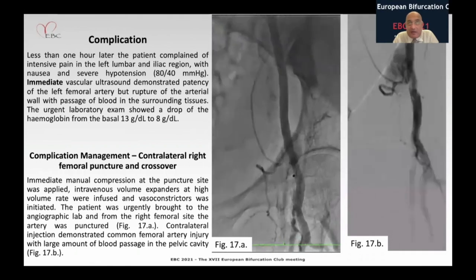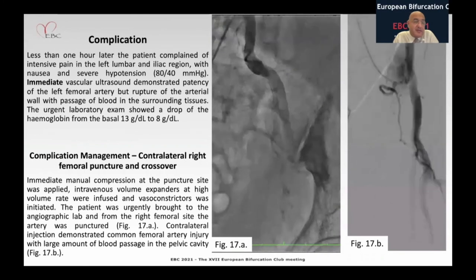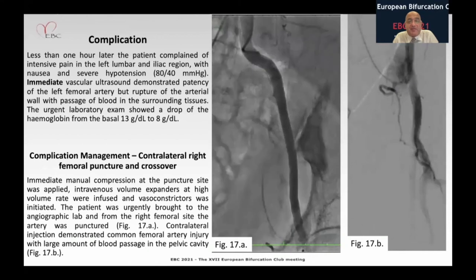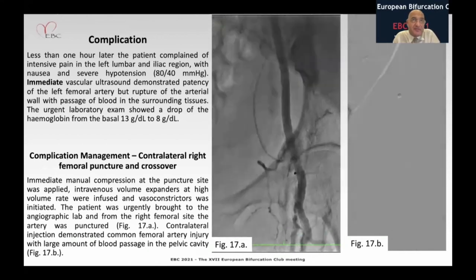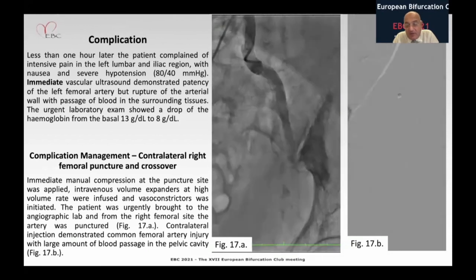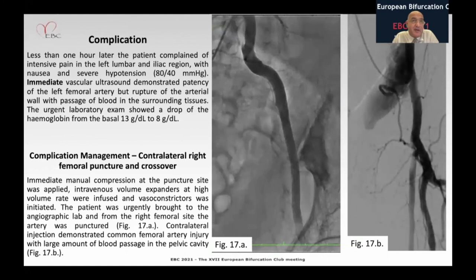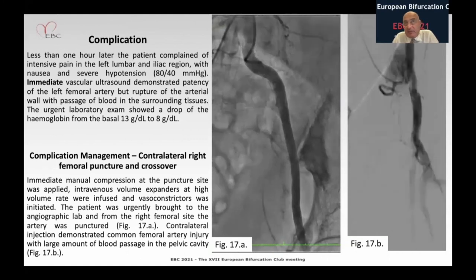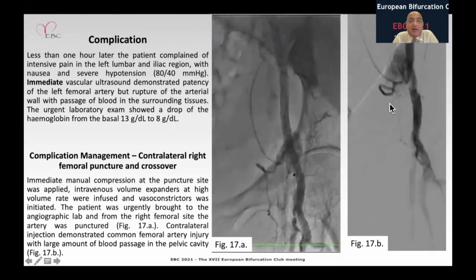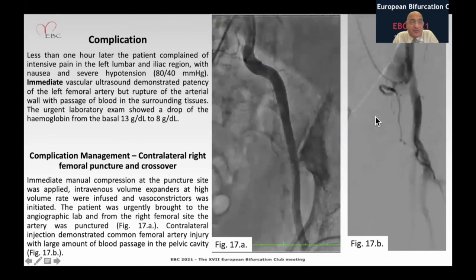And the hemoglobin in urgent evaluation went down from 13 grams per deciliter to 8 grams per deciliter. The patient was immediately transferred back to our cath lab while compressing the femoral artery. And from the right femoral artery by crossover, we saw the rupture of the femoral artery exactly on the place of the MANTA closure device.